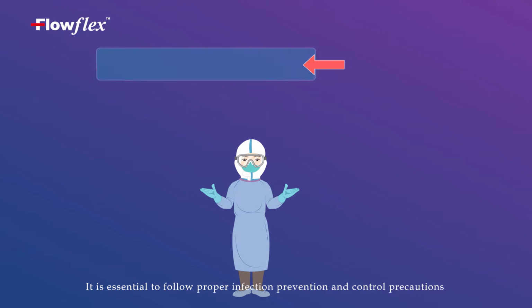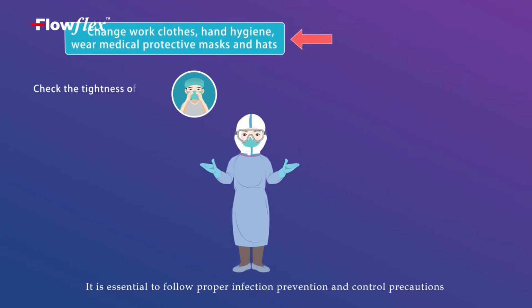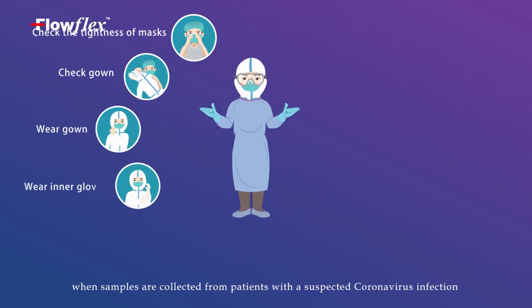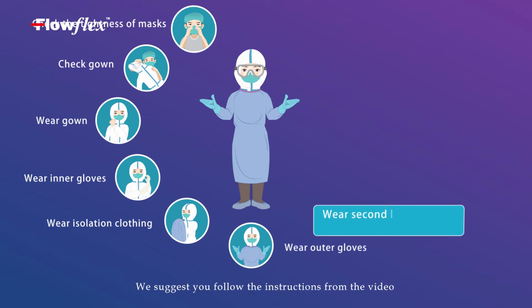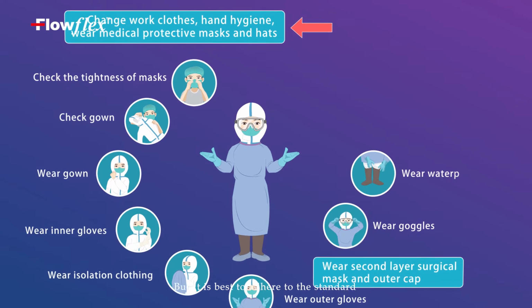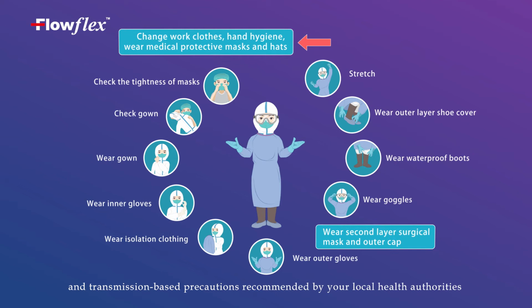It is essential to follow proper infection prevention and control precautions when samples are collected from patients with a suspected coronavirus infection. We suggest you follow the instructions from the video, but it is best to adhere to the standard and transmission-based precautions recommended by your local health authorities.